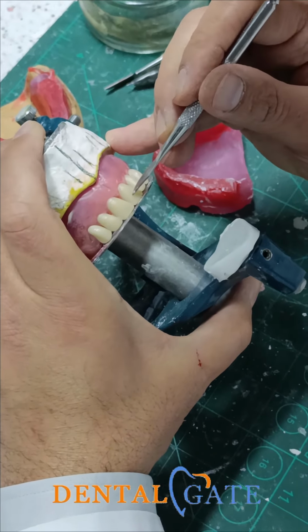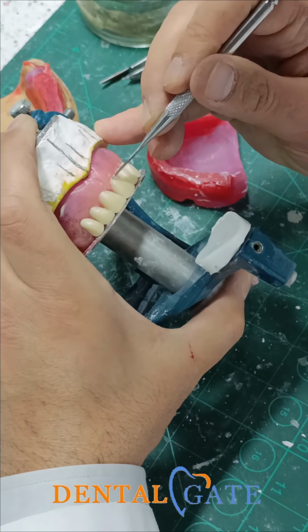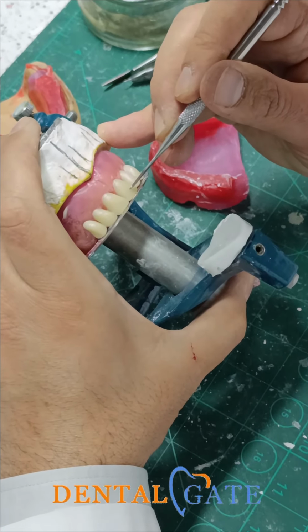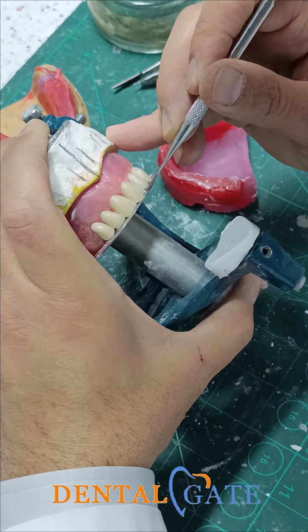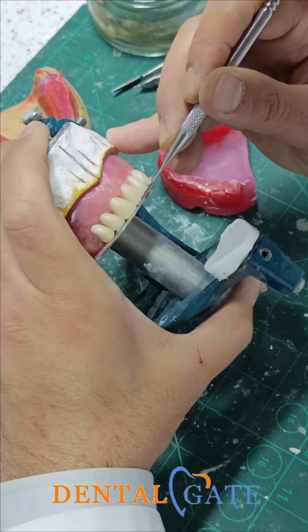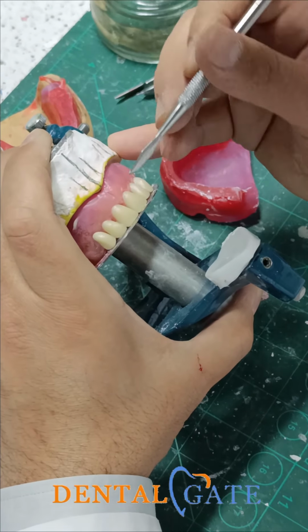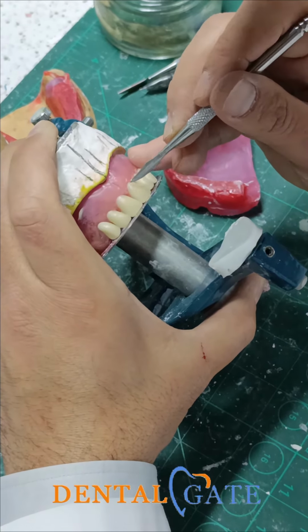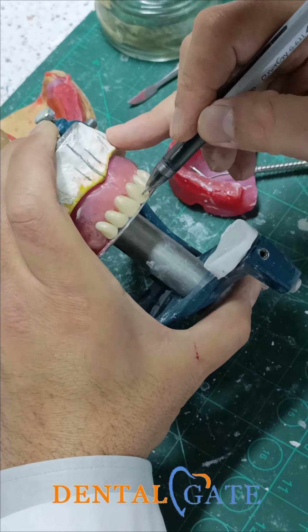The central incisor, the long axis of the central incisor, should be vertical. Okay? So the incisal edge should be ultimately attached to the table. Okay, there is no inclination in the long axis. Okay, regarding the central incisor.